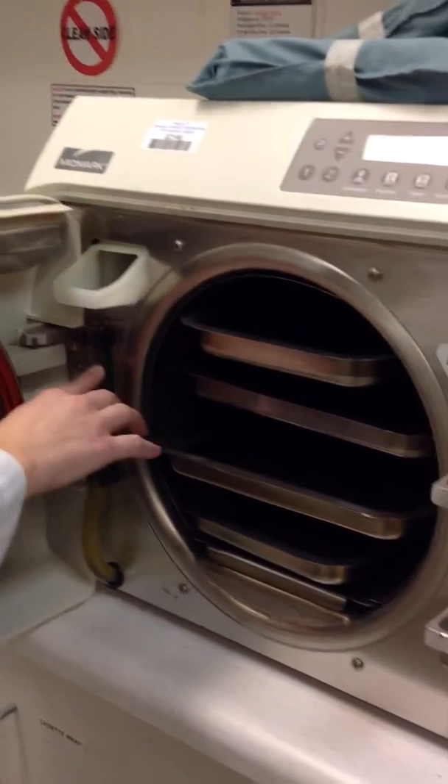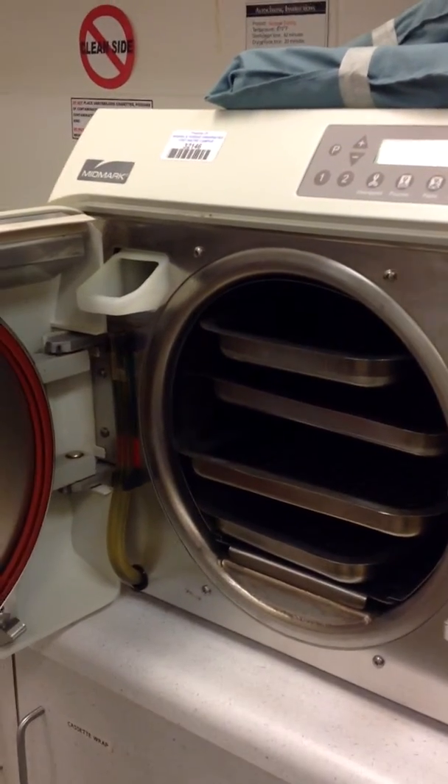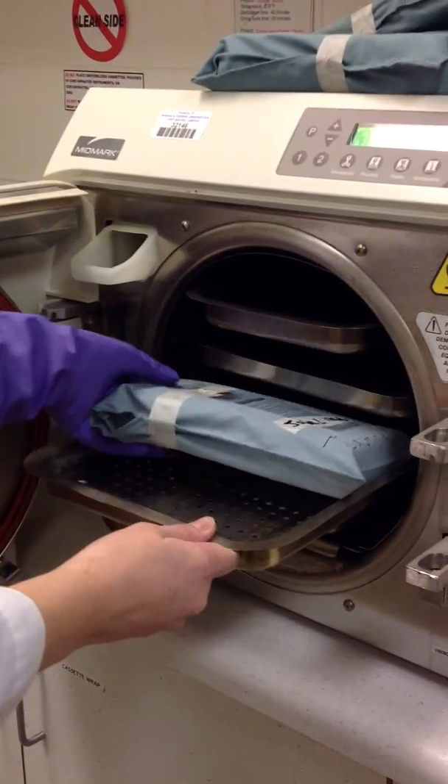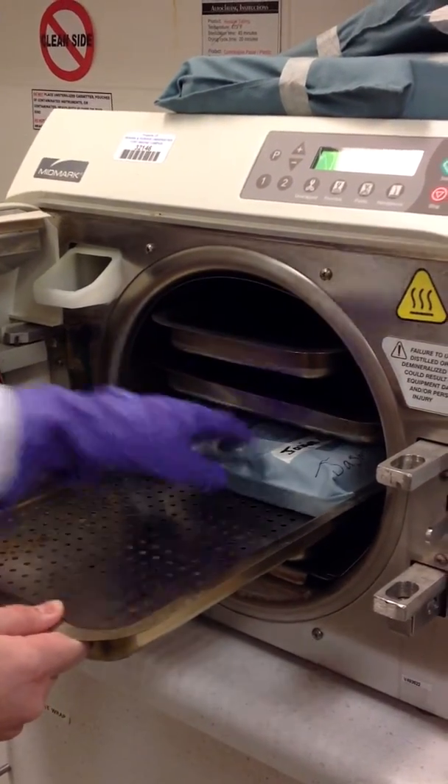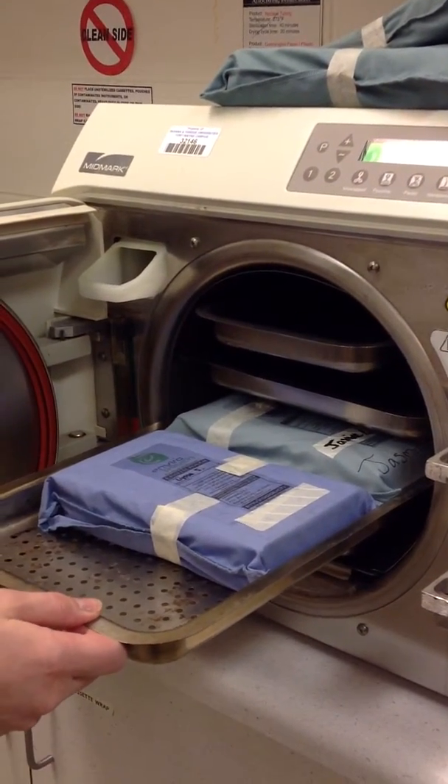Once you fill the water and it's in the green, we'll start loading the autoclave. Using your purple gloves, you're going to fill the trays of the autoclave, not overflowing.